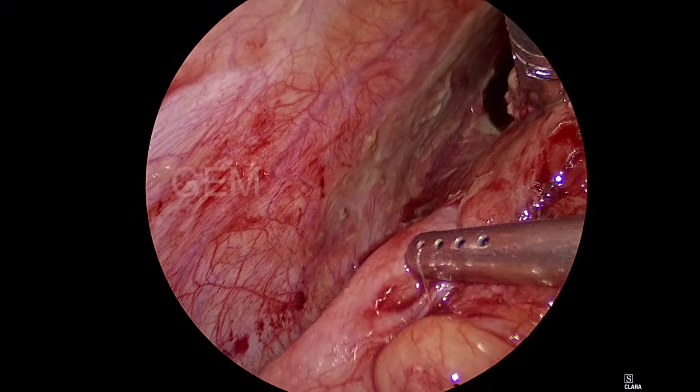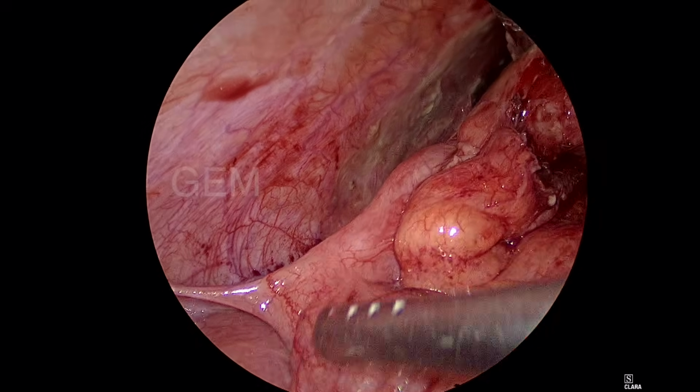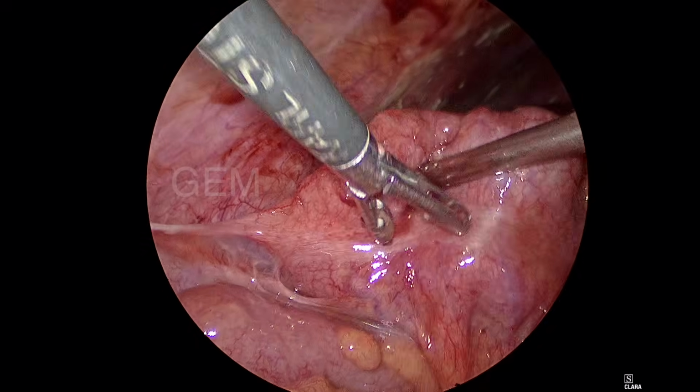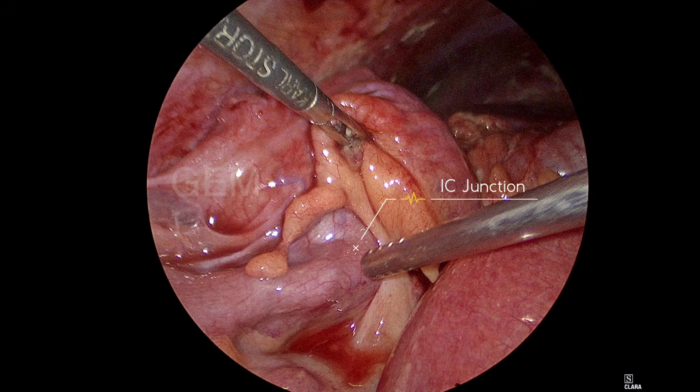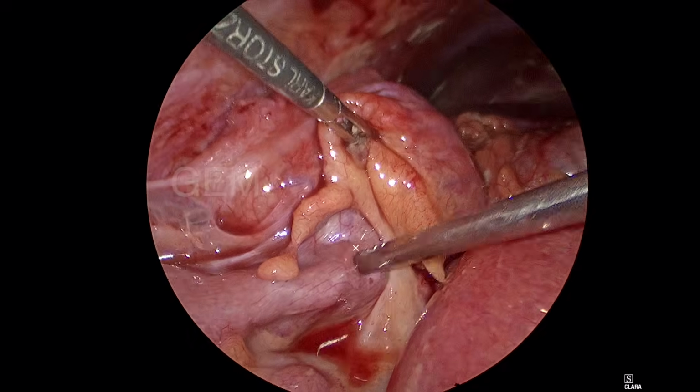In between, that looks like the base of the appendix, and it looks relatively normal compared with the other part of the appendix. So that is the IC junction, the ileocecal junction, very clearly seen.